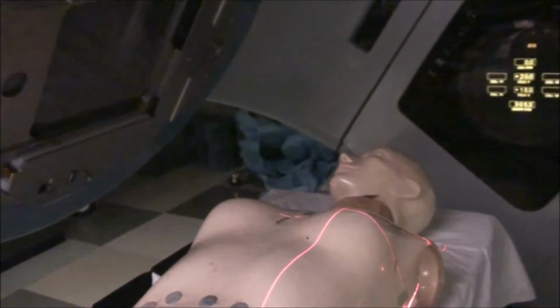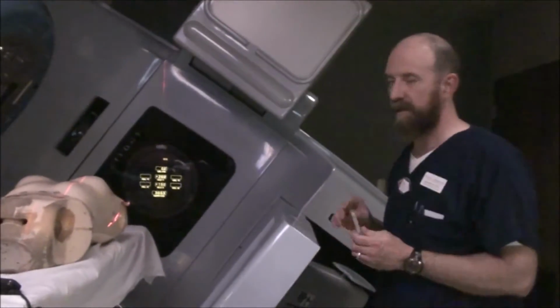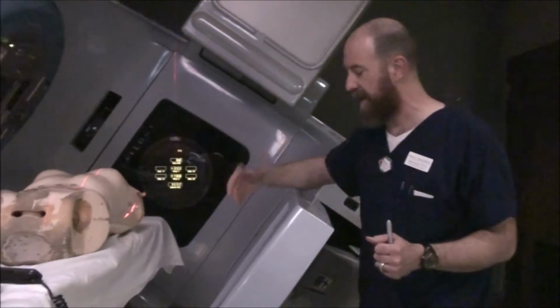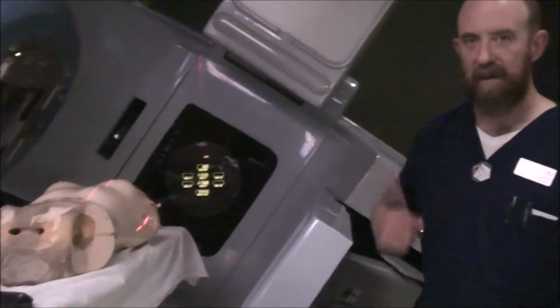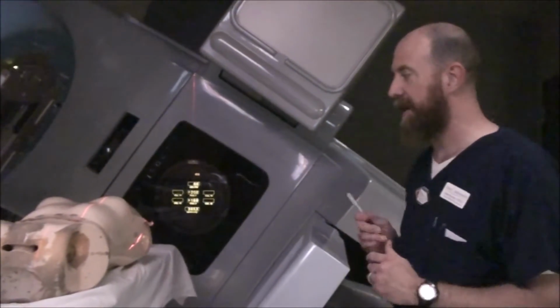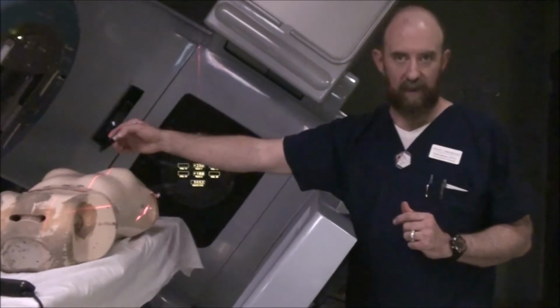Once you've read your SSD, you've marked your patient, you're going to go out and you're going to take film. And just like before, you're going to set your film, you're going to set your TFD, you're going to center your image intensifier, and you're going to put medial left tangent for your field marker. Take your film, get it approved. Once it's approved, come back in, and you're going to go ahead and mark any other relevant field borders.